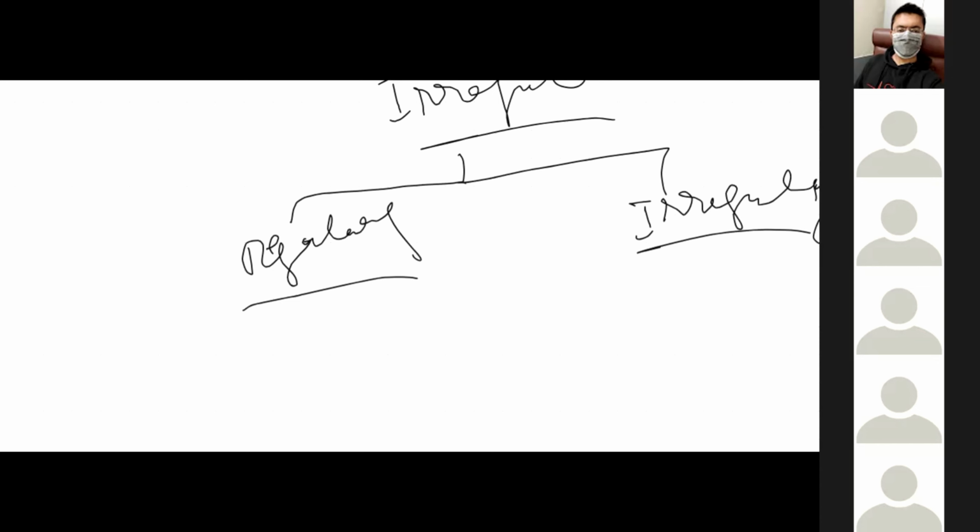This is what you can do with an irregular rhythm, wherever you find it. You can do this, or you can count the QRS complexes of 30 big squares and then multiply it with 10. So this is a 6-second strip and this is a 10-second strip. I hope I made my point clear over here.